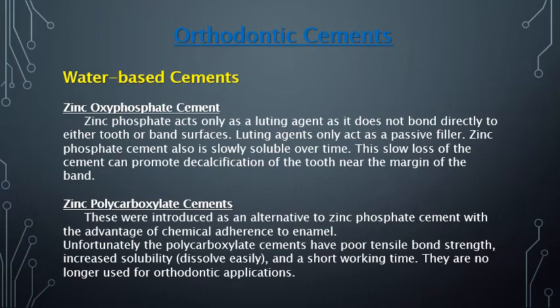Orthodontic cements. Water-based cements. Zinc oxyphosphate cement. Zinc phosphate acts only as a luting cement as it does not bond directly to either tooth or band surface. Luting agents only act as a passive filler. Zinc phosphate cement is also slowly soluble over time. This slow loss of cement can promote decalcification of the tooth near the margin of the band.